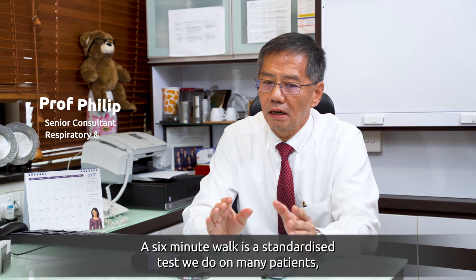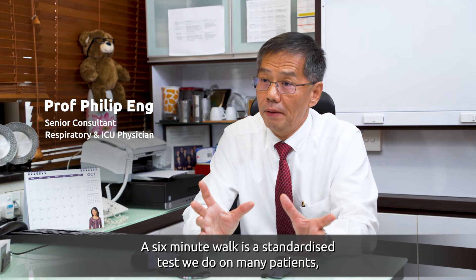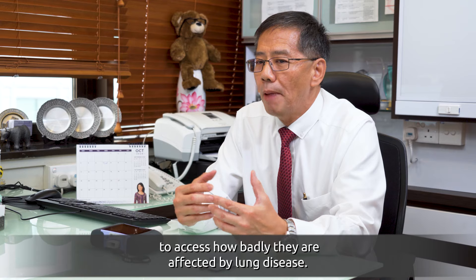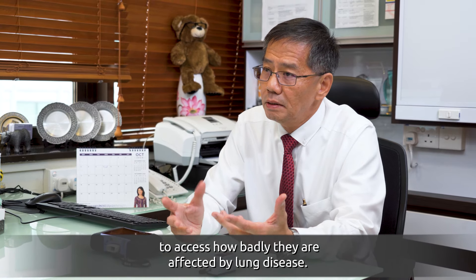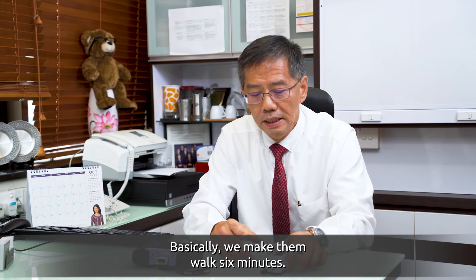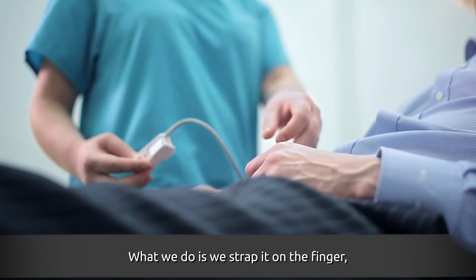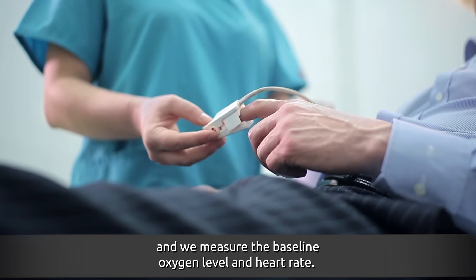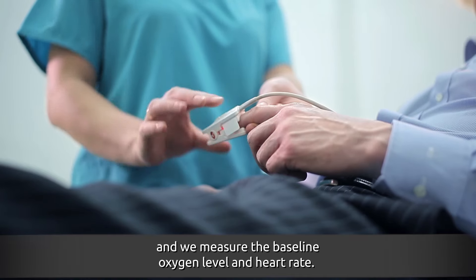The 6-minute walk test is a standardized test we do on many patients to assess their functional status — how badly they are affected by heart or lung disease. We make them walk for 6 minutes and use a device called a pulse oximeter, which we strap onto their finger to measure baseline oxygen level and heart rate.